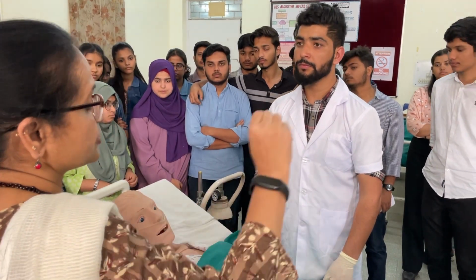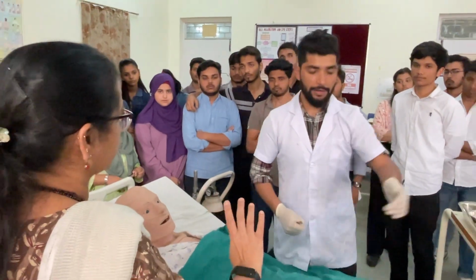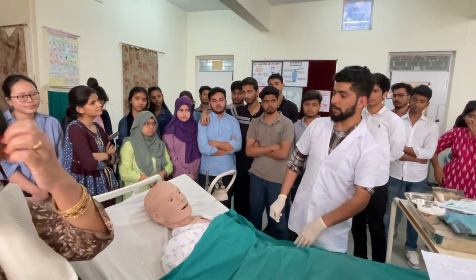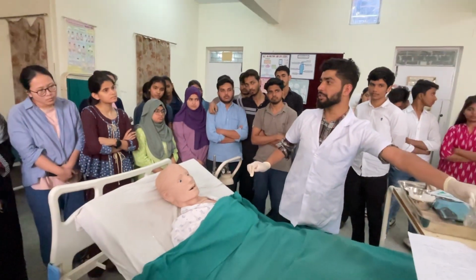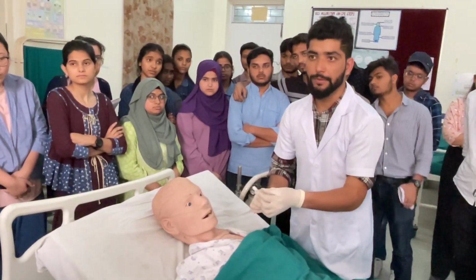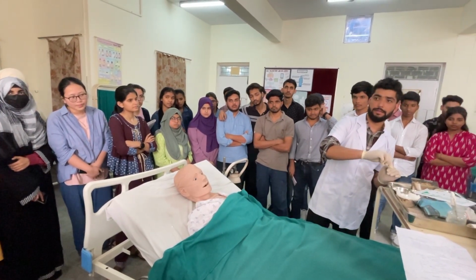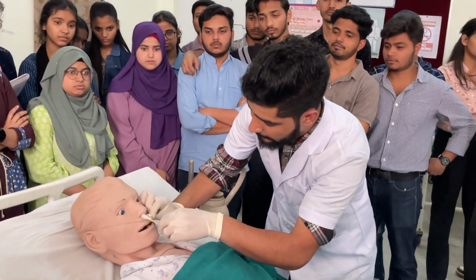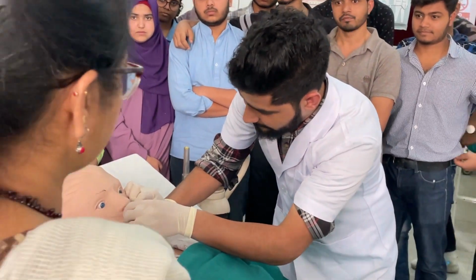So that's why we should always, you have kept this swab stick, but you have not mentioned what you have kept it for. This is for this purpose. You have to clean it. So before providing oxygen therapy to the patient, we have to clean the nostrils by means of this swab stick. Don't put it dry. Use normal saline, not even tap water. Normal saline only. Nostrils should be clean. And your swab stick is so big that the cotton will get stuck.